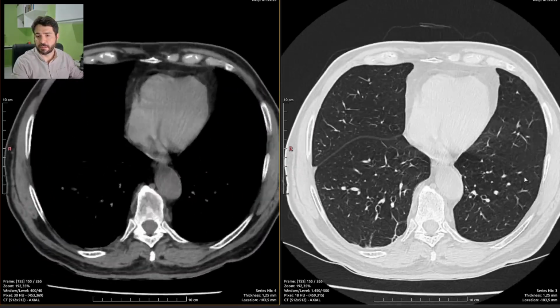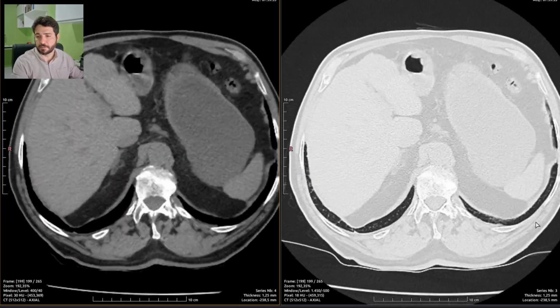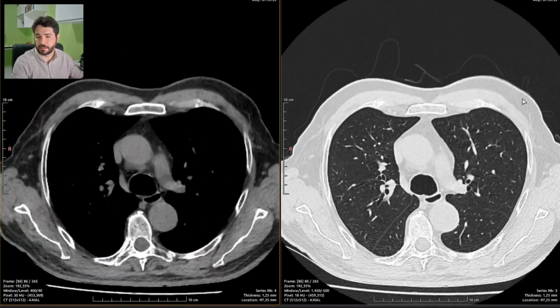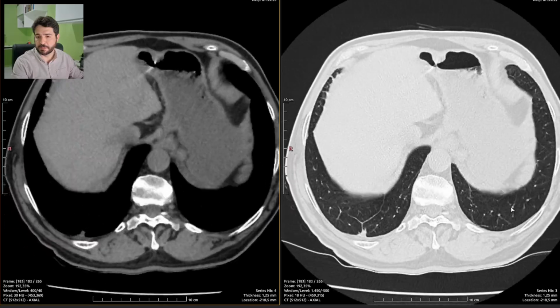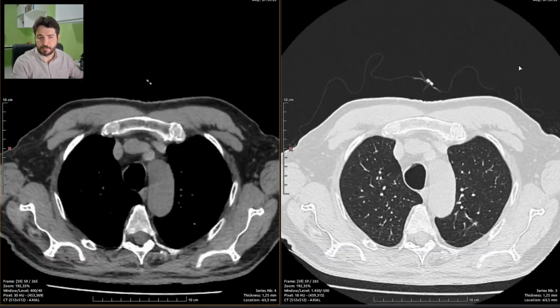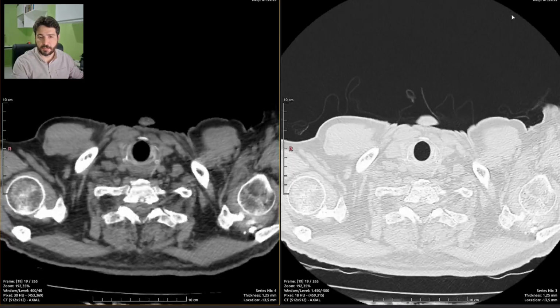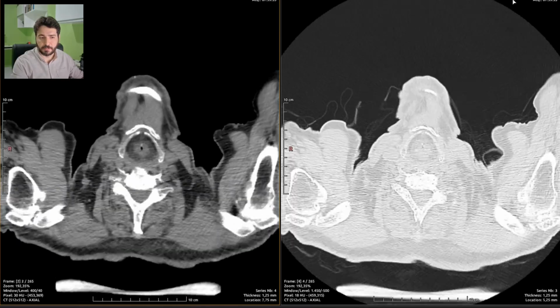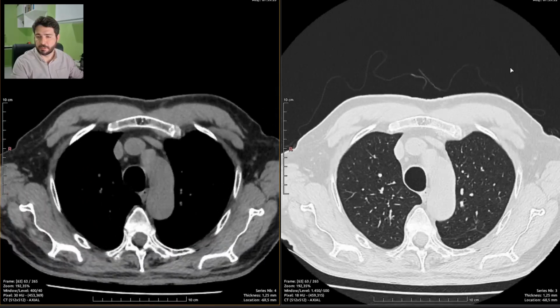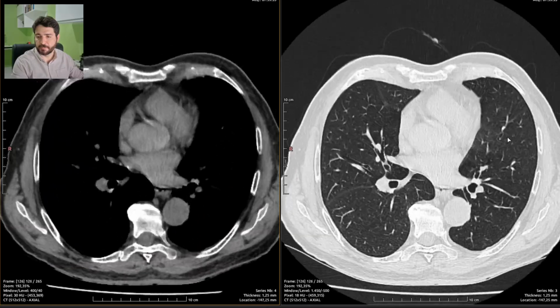So if he isn't a severely ill patient, we won't really find any severe disease, and so the exam has good quality. Usually the worst quality exams belong to the worst disease, the patients that are very sick.